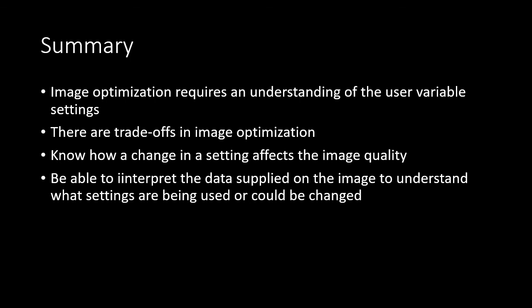In summary, when I'm going to take an ultrasound image, the first thing I want to know is, am I getting a superficial structure or a deep structure? That's going to make me choose a linear probe for high resolution superficial structures, or a curved probe or a phased probe for deeper structures. If I have a nice sonographic window, I hope to use the curved linear probe, which will give me higher resolution images than a phased or sector probe.